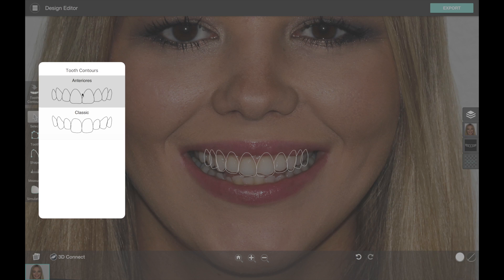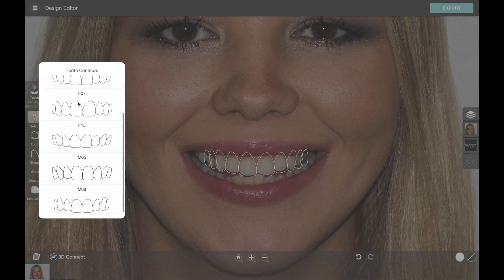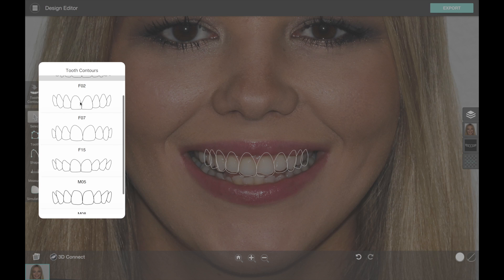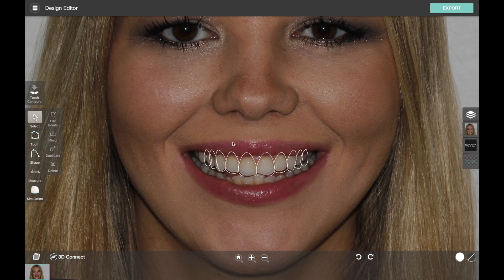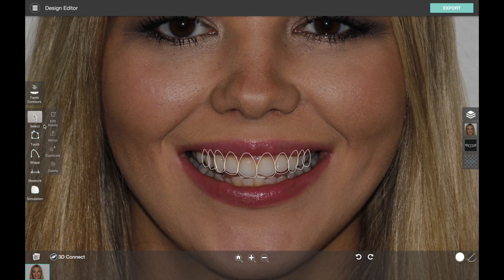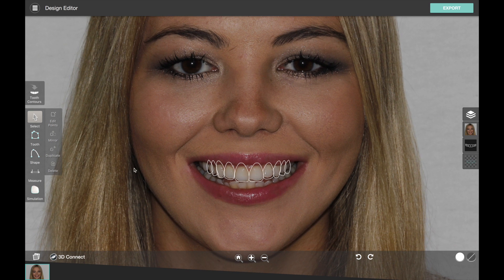Smile Designer comes with a library of about 12 different templates for tooth contours. We have the anterioris collection from Yan Haito, and if I select a new contour — let's say F2 — as soon as I click on it it's going to morph the teeth to this new shape. Using undo and redo, you can see it basically morphed the teeth right where they were into a new contour. I can always draw a tooth from scratch using the tooth tool, but for this case I'm going to stick with the default template because I like the way it looks. The shape tool and measure tool we'll cover in a separate video, and in just a couple of seconds I've created this smile frame.